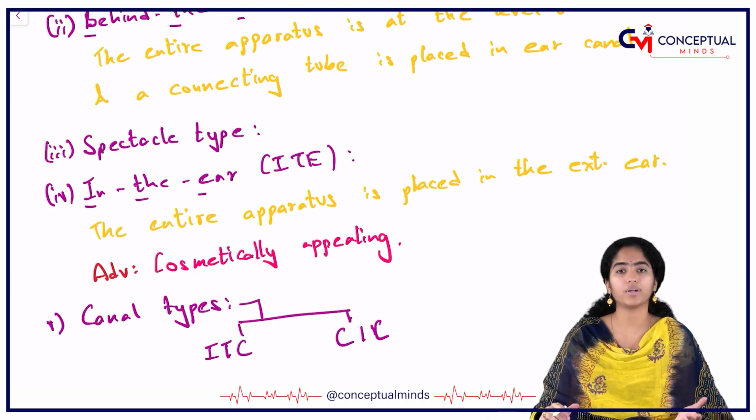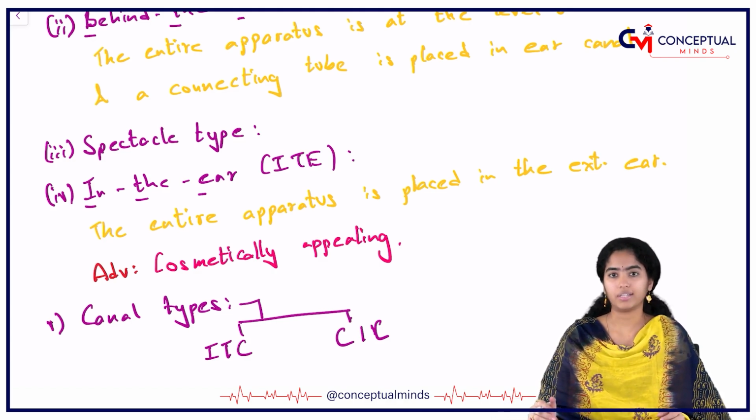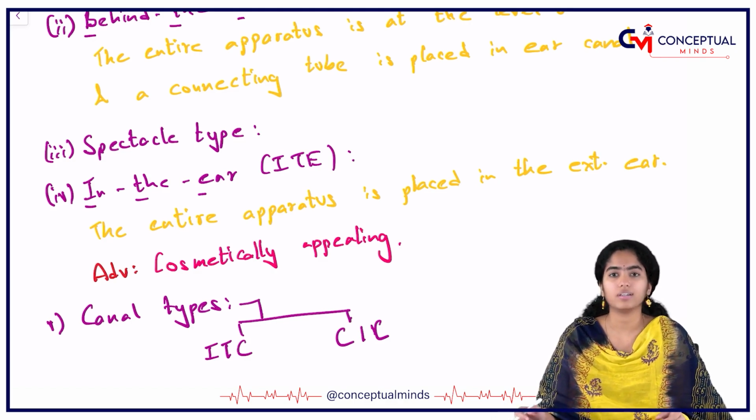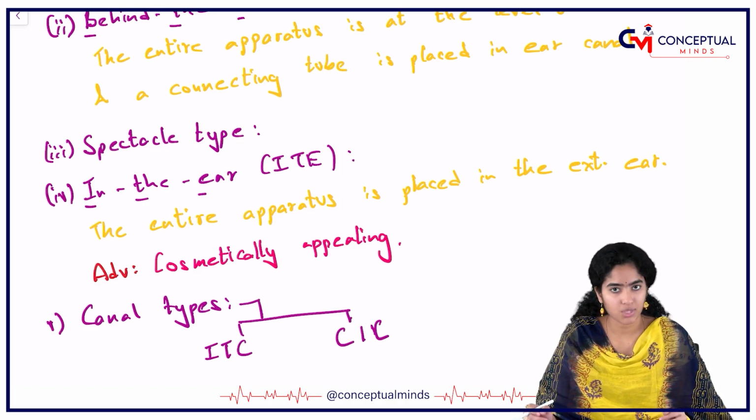Okay. Before moving forward, let us understand what are the indications for a hearing aid. Who should use hearing aids? Now suppose a patient has a tympanic membrane perforation. Will you prescribe hearing aids for that patient?